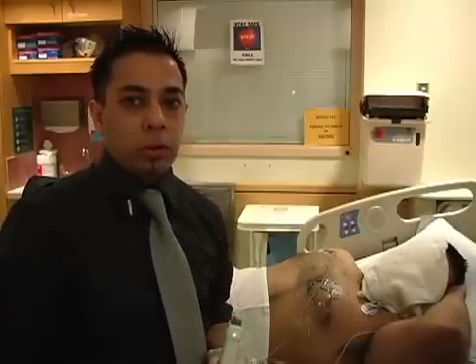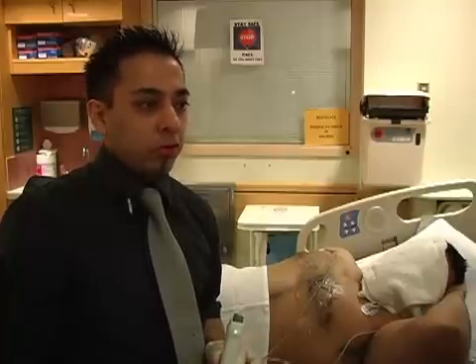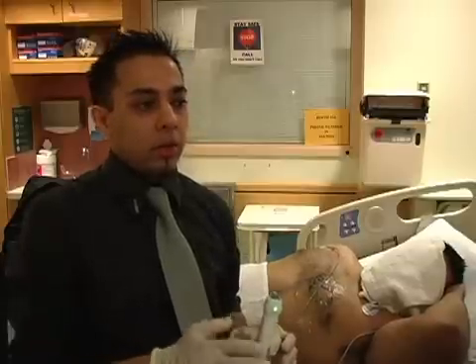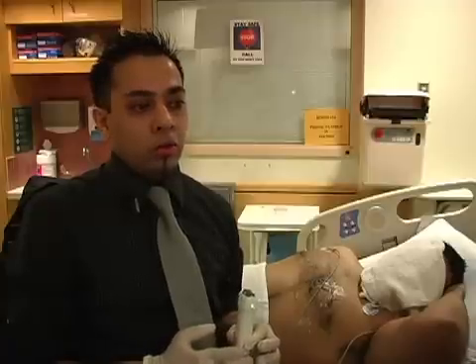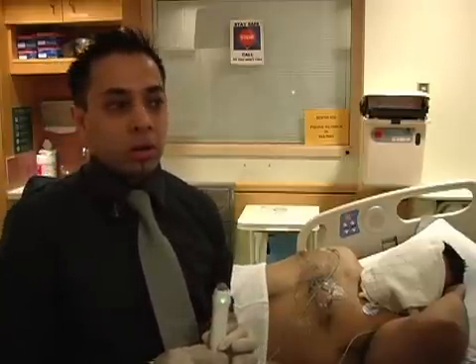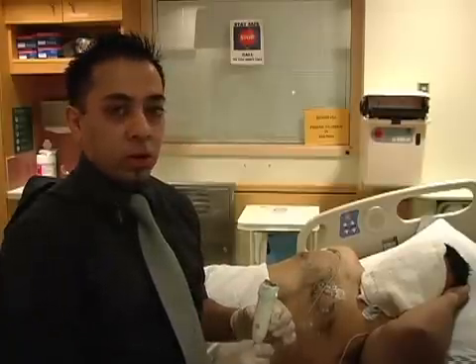The next view is the apical four-chamber view — everyone's favorite view, as you see all four chambers of the heart. Again, you want the patient in the left lateral decubitus position, with the probe close to the apex of the heart. Placement depends on the individual, as everyone's heart is situated a little differently. If you examine the patient beforehand, place the probe close to the point of maximal impulse — usually lower and a little lateral to the left nipple. The marker of the probe should face towards the patient's left side, at the three o'clock position.